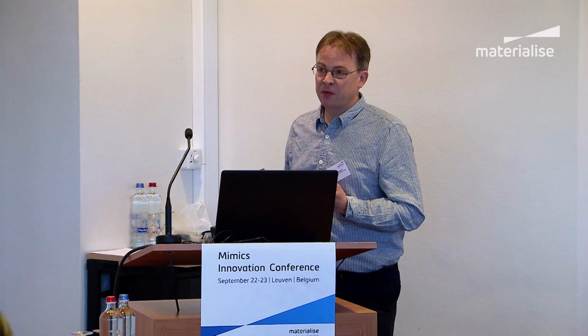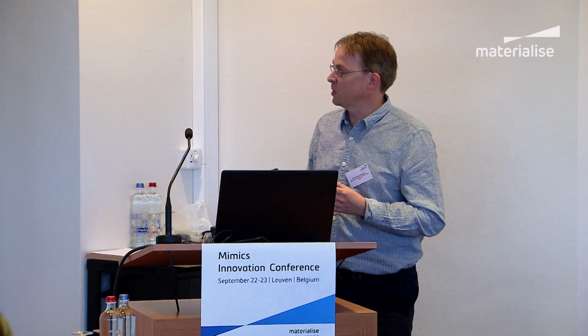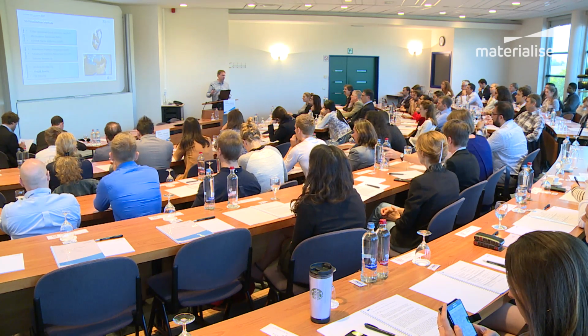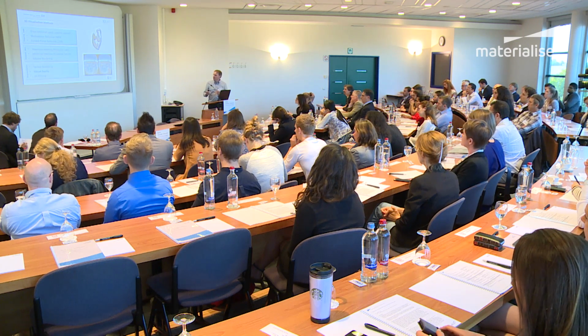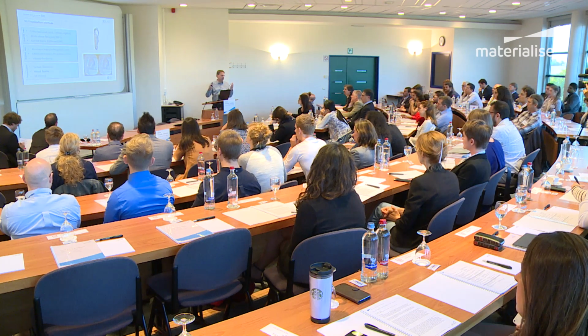And the data is already in a format which can then be readily passed on to other systems, such as a virtual reality system. And we've been working with the University of Sheffield to perform a virtual colonoscopy, a true virtual colonoscopy, where we can effectively fly over the colon, but then also fly through it and walk through it with a headset on.